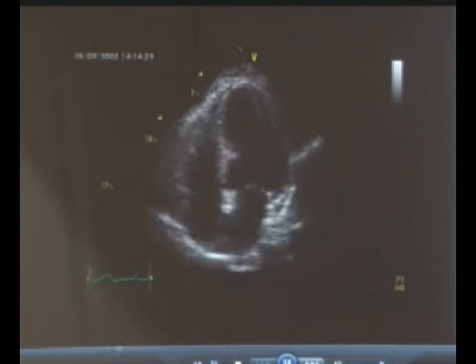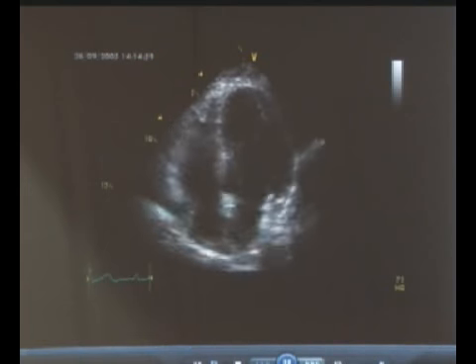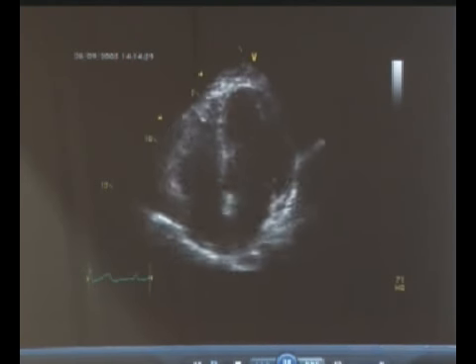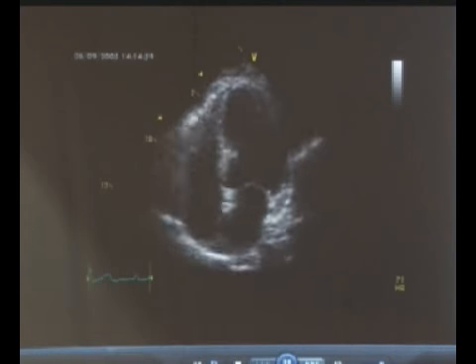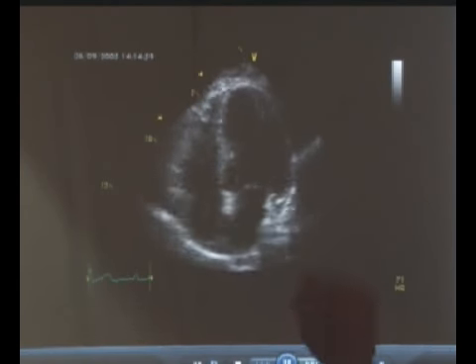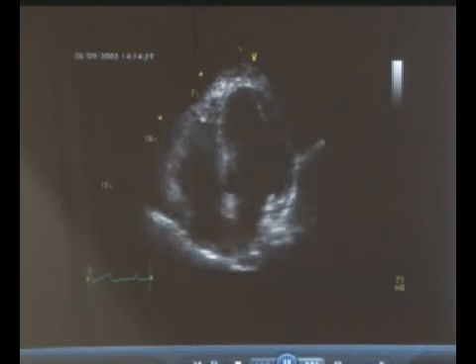If you do at least 6 months of workup, you will do wall motions and you will be able to calculate good valvular gradients. Are we clear what you mean by hypo, what you mean by akinetic? Are we clear or not? That's what your impression should be.